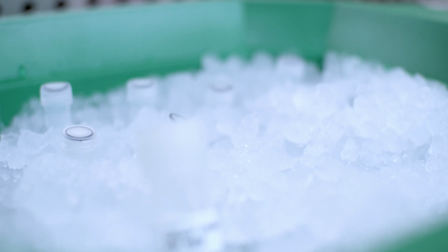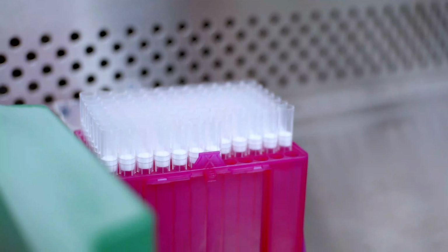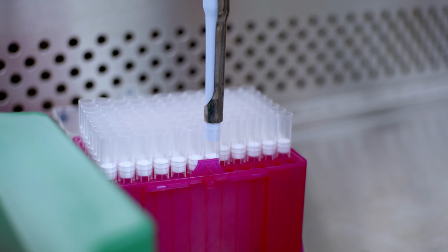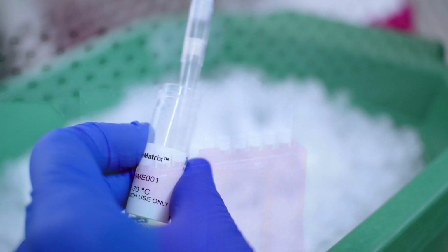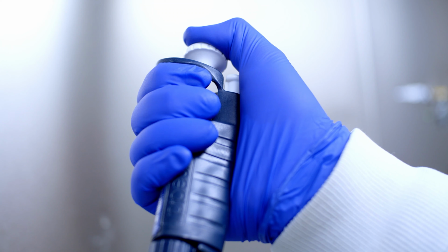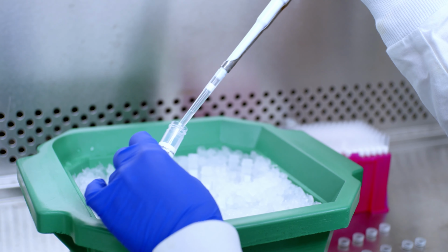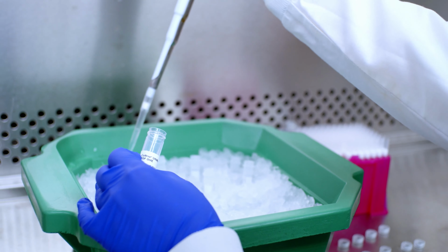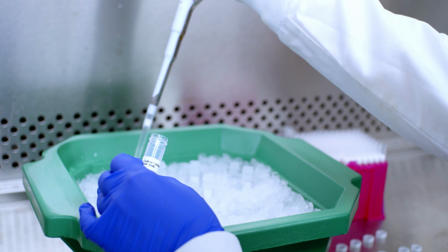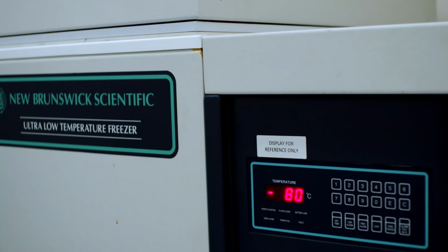To ensure the matrix stays cold, we recommend chilling all pipettes and pre-labeled vials in the -20 Celsius freezer prior to aliquoting. Mix Cultrex BME by pipetting up and down to achieve a homogeneous solution. Aliquot the matrix at a dilution recommended by the manufacturer or that suits your desired application. Use reverse pipetting techniques to minimize bubble formation when pipetting Cultrex BME. You can store aliquots of Cultrex BME at -80 Celsius for up to 6 months.